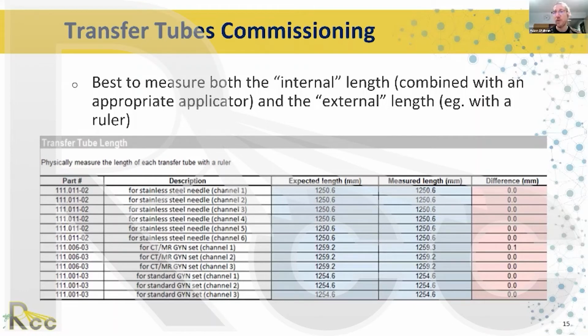And now when we go to the machine, for every fraction for every patient, we measure that combination of transfer tube and applicator, and we look for just that it remains consistent at the 1,502. So again, our gold standard is the autoradiograph. And this other tool may or may not align perfectly, but as long as we're looking for consistency in results as we go further.